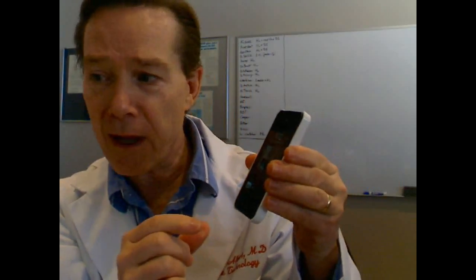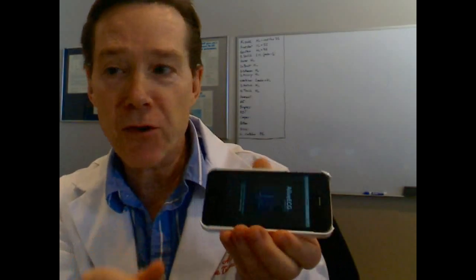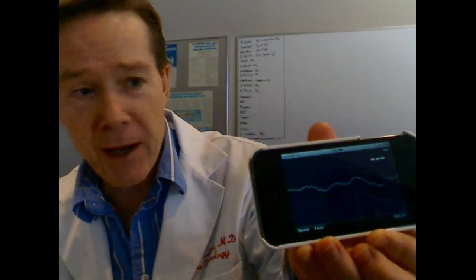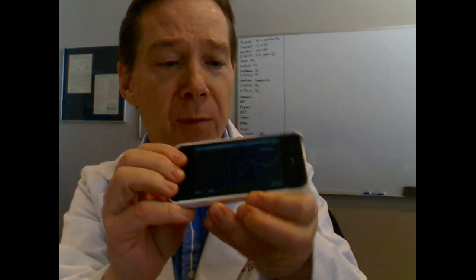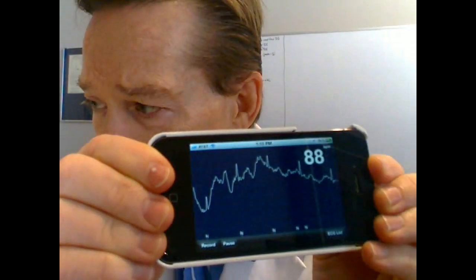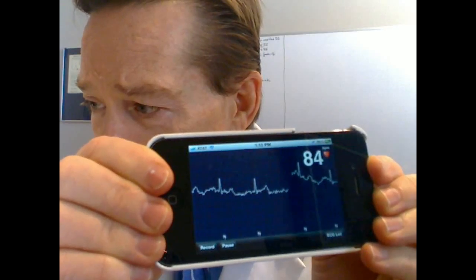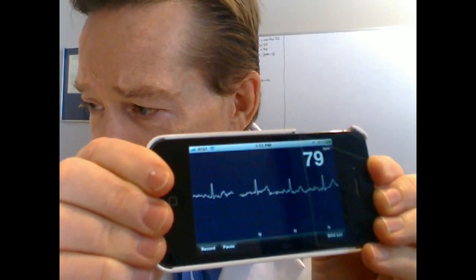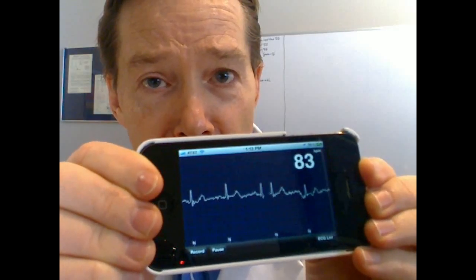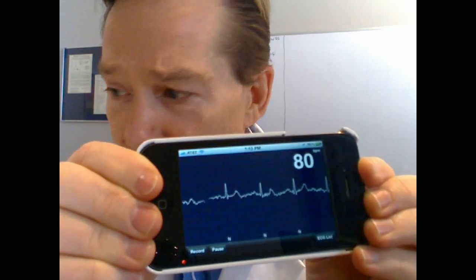Now the next thing I do is I activate the iPhone ECG application, and you will see that come up here and it is showing you the baseline. Now I'm going to grab this by my hands and we will move it forward. And there you see my ECG, and this is Lead 1. Lead 1 is left arm minus right arm, conventional ECG.